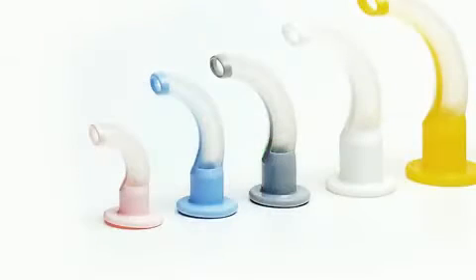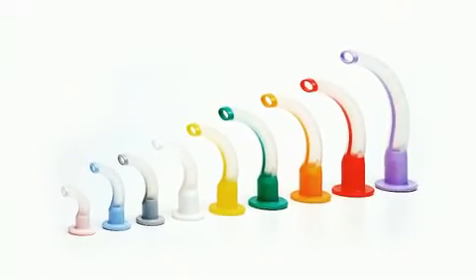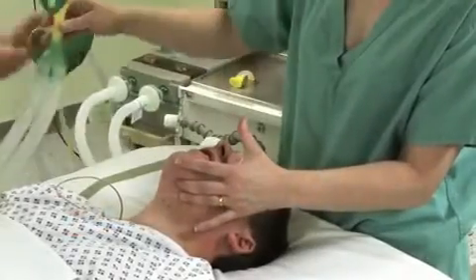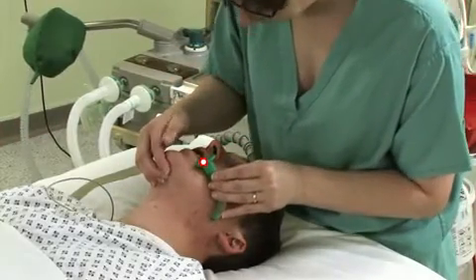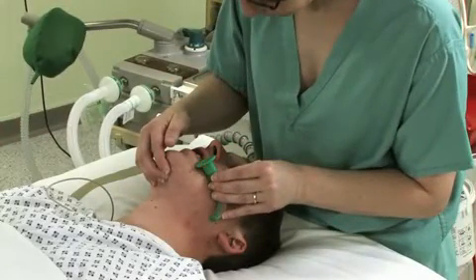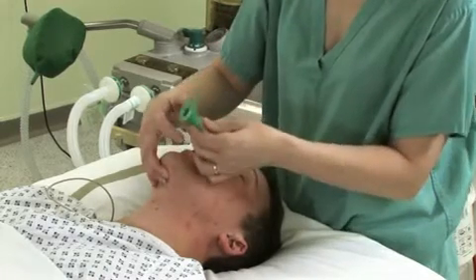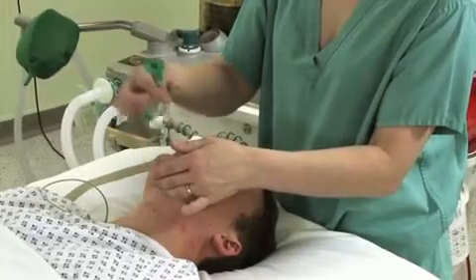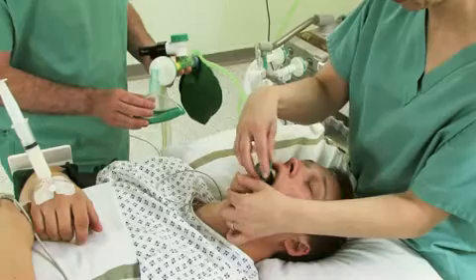Oropharyngeal airways come in a variety of sizes, from size 000 to size 5. The appropriate size is determined by placing the airway adjacent to the patient's face with a flange at the corner of the mouth. The tip of the airway should end approximately at the angle of the jaw. In the adult patient, the airway should be inserted with the pharyngeal opening facing the roof of the mouth, then rotated 180 degrees as it passes the back of the tongue.